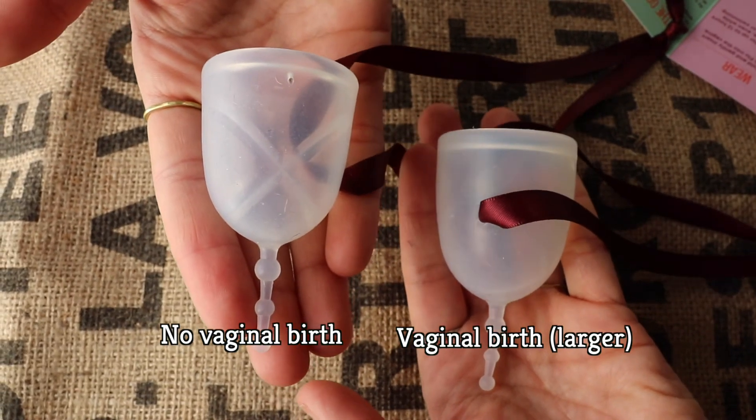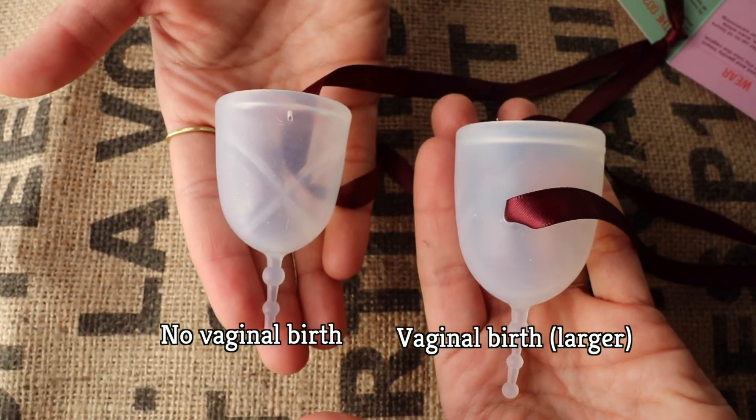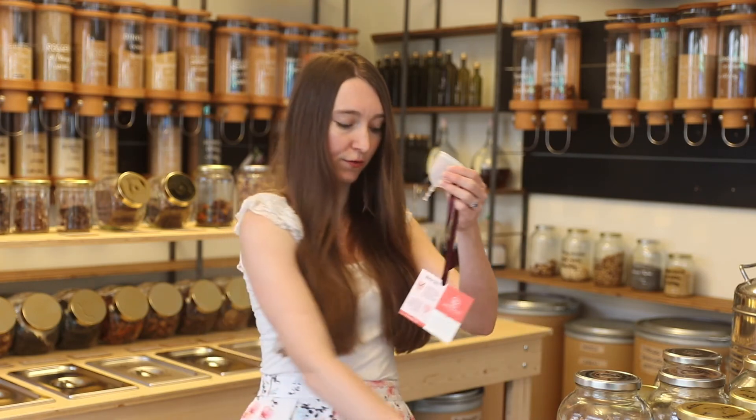There are also cups made for women who have had vaginal births, or who have a really heavy flow or a high cervix. They can be kind of intimidating. Even though I'm a mom now, I have not had the courage to try the bigger ones — I'm fine using the smaller ones. But this is what a larger one would look like. This is the large one from Glad Rags, and for comparison, this is the small one from Glad Rags.